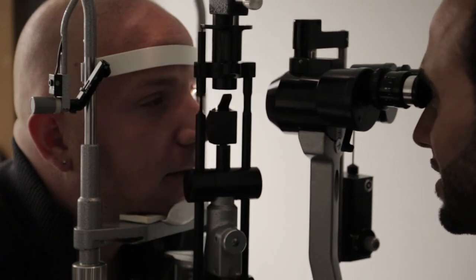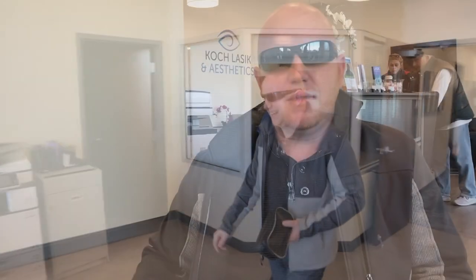Just finished up with Daniel — he did beautifully. Most patients tend to think it was a little easier than they anticipated. I think most of the time it's the fear of the unknown that gets them, but they come in and say, 'That wasn't that bad — if I knew it was that easy, I would have done it a whole lot sooner.' He'll be in the waiting room for about five minutes; I'll check him under the microscope, make sure everything is right, then give him the thumbs up and send him home. It feels awesome — I'm excited. It was quick, simple, easy, painless, and I wish I had done it years ago. I let my nerves get the best of me for many years. The timing was literally seconds and there was no pain involved. I would highly recommend it to anyone thinking about doing it.